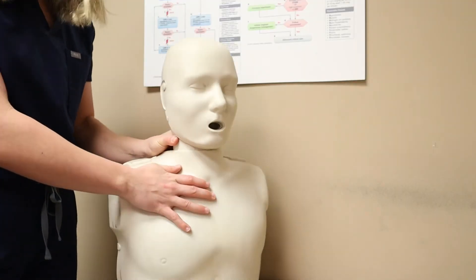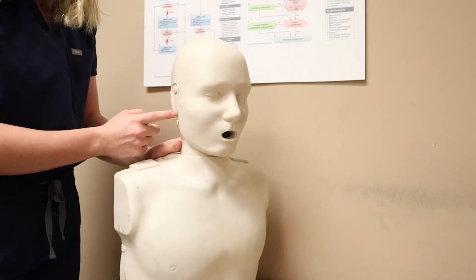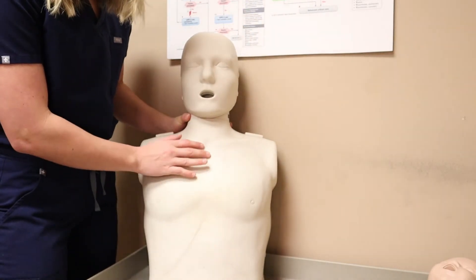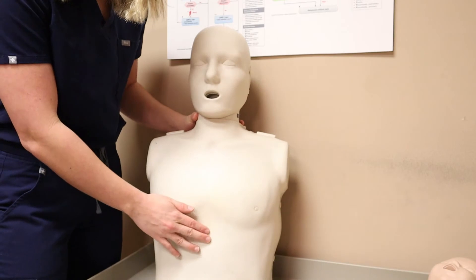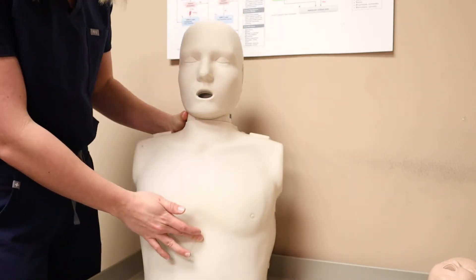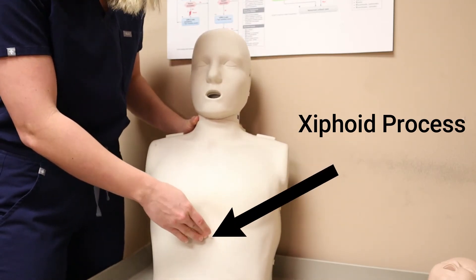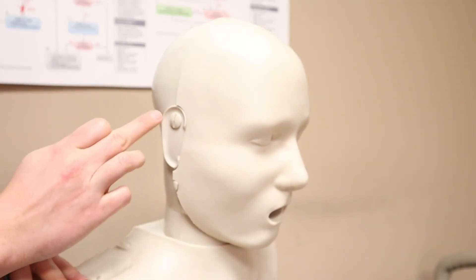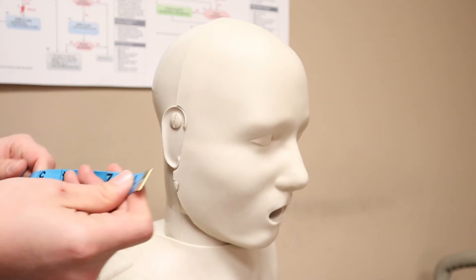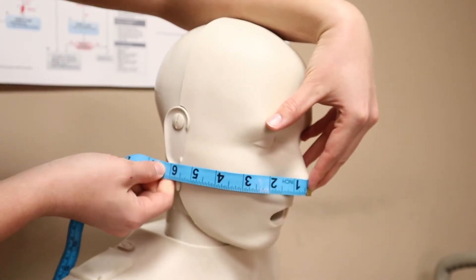Using the mannequin here, the technique that we always used was going from the nose — starting to measure at the nose — going to the ear lobe, and then going down to the xiphoid process on the chest. If you don't remember the xiphoid process, it is the lowest point at the bottom of the sternum; it's actually a point of cartilage, not bone. Let's first measure the nose to the ear lobe, starting at the tip of the nose and going to the bottom of the ear lobe. Nose to ear lobe is six inches.